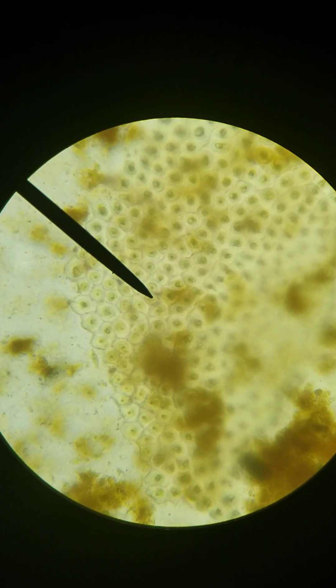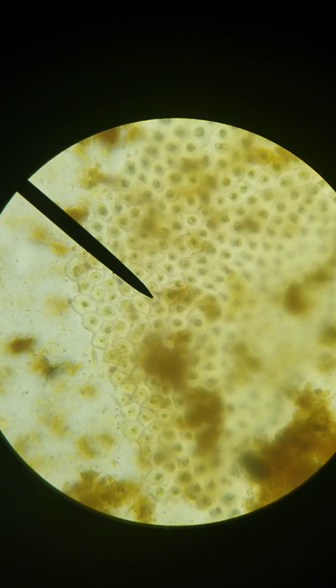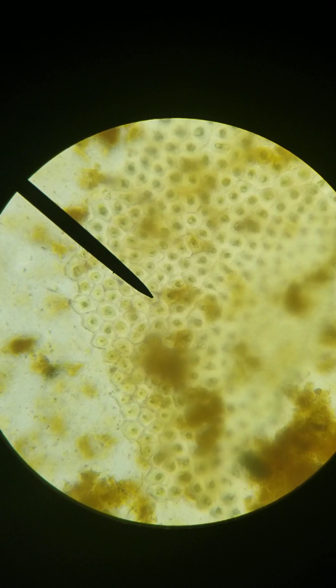Hello everyone, and we are on the hunt for the pinworm known as Enterobius vermicularis. It is the one that terrorizes diaper wearers all over the world. The adult female comes out in the middle of the night and lays her eggs around the anal opening. Then the baby scratches the itch and ends up moving the eggs into his or her mouth, and the cycle starts all over again.